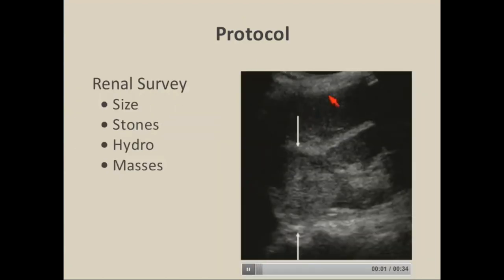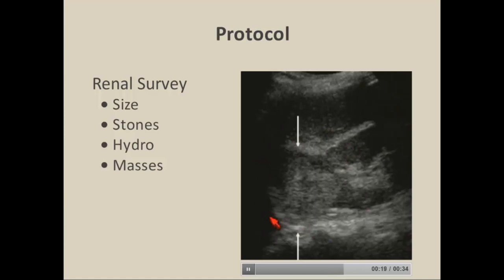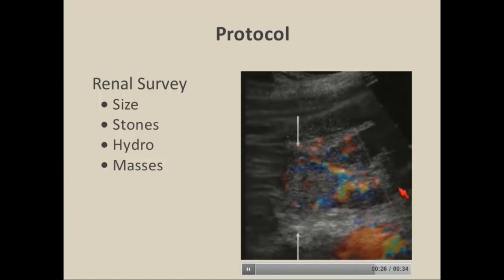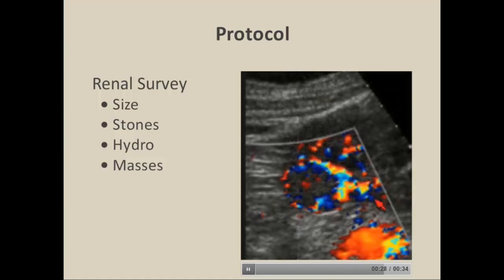Here's a look at a kidney as part of our renal survey. We evaluate size, echogenicity, presence of stones, hydronephrosis, or masses. In this case of a patient presenting with hypertension, you can see a large mass projecting from the upper pole of the kidney — obviously an important diagnosis not to overlook. It's also important to turn color on, because renal cell carcinoma is typically hypervascular relative to the normal parenchyma.